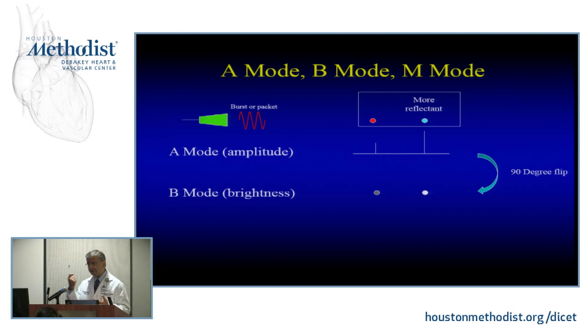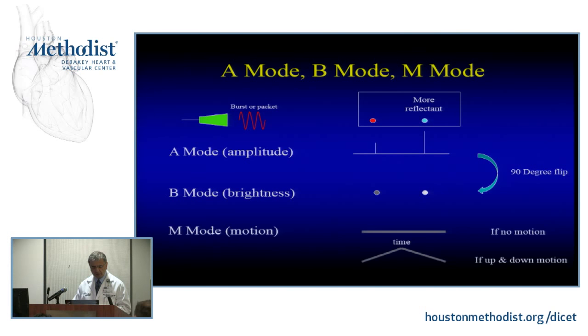These dots of ultrasound are actually the brightness. It's a B color at times, if you colorize it, if you will. So if you take that vector and look at you, then I know what the intensity of that reflectant is. So I may differentiate the blood, which doesn't have much, to muscle, to calcification, to metallic thing that is very reflectant, right? So that's a B mode.